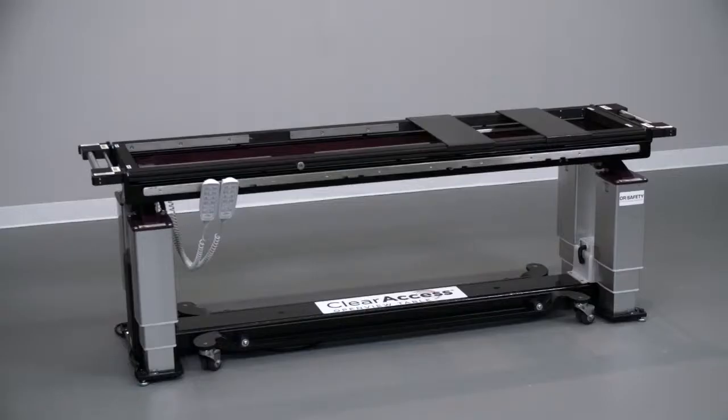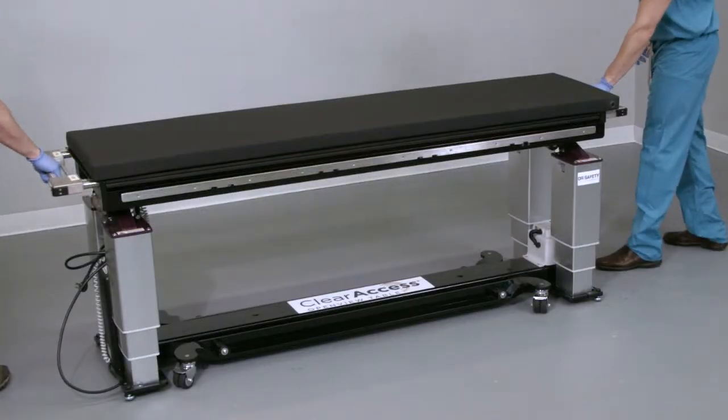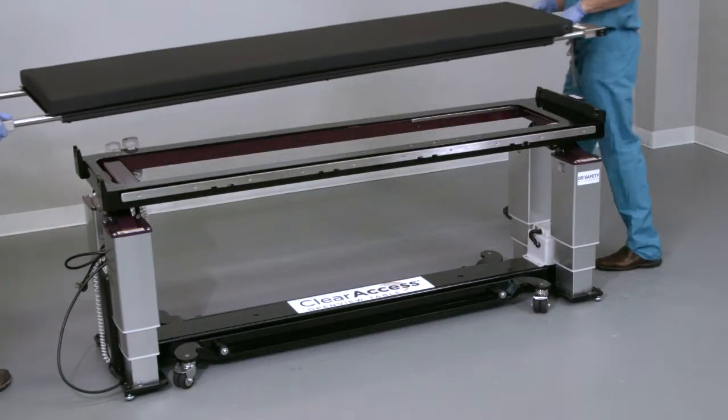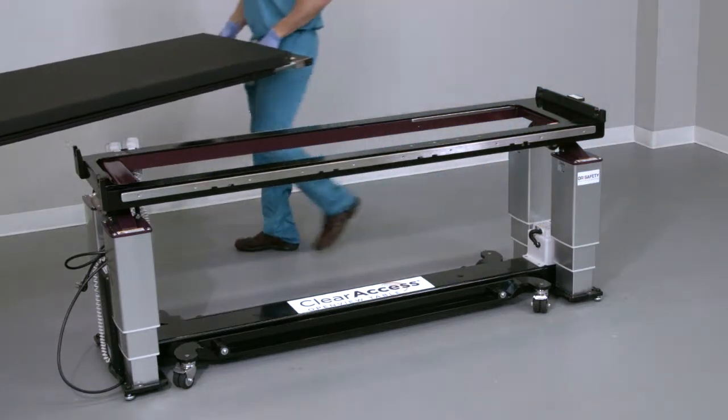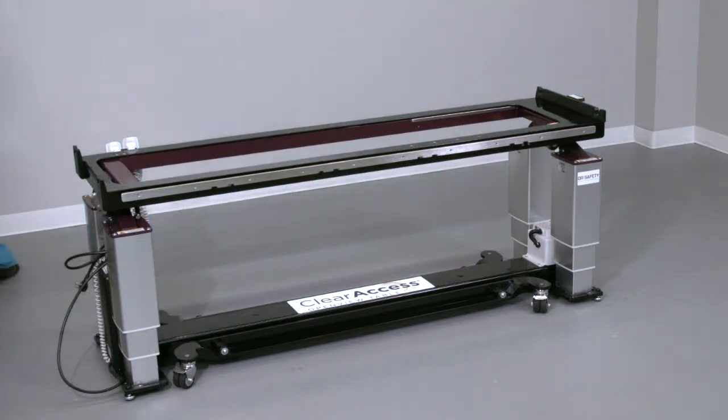If the prone platform is not already installed, it's likely that the supine platform, or flat top, is in place. If this is the case, remove the supine platform by grasping the silver handles at both ends of the table. Extend the handles by pulling outward, then lift and remove the supine platform from the ClearAccess table base.